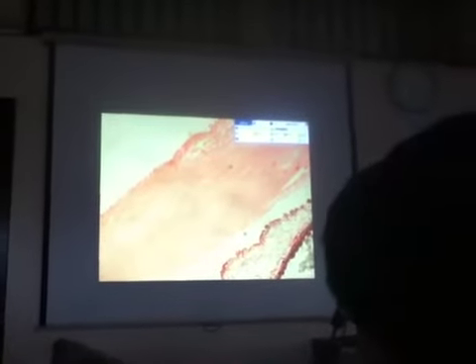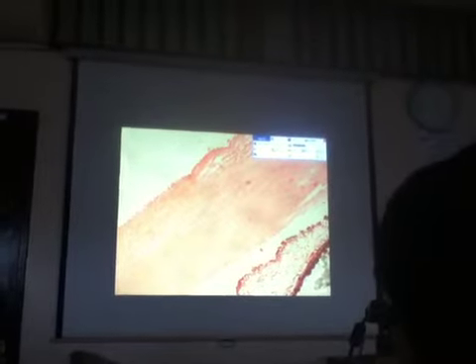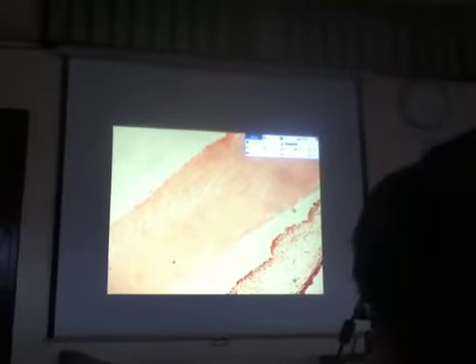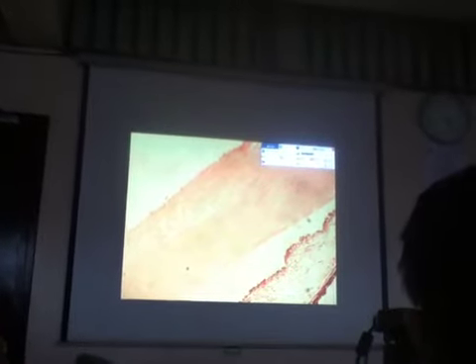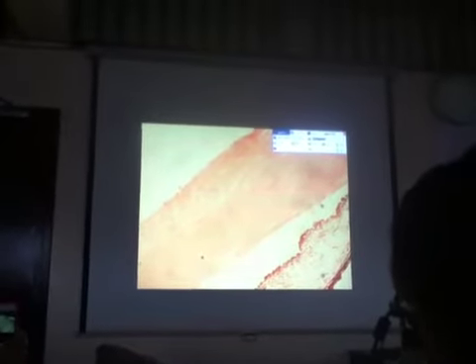And then the thickest layer composing the cornea, which is composed of dense regular connective tissue. As you can see, the fibroblasts are arranged parallel with each other in linear configuration. How will you call this thick portion of the cornea?